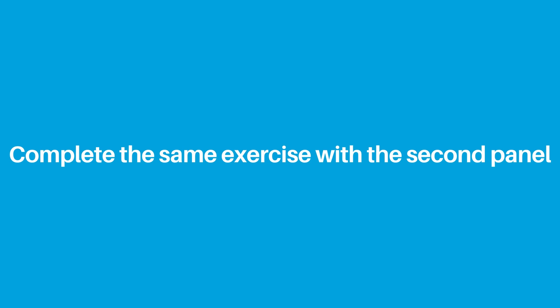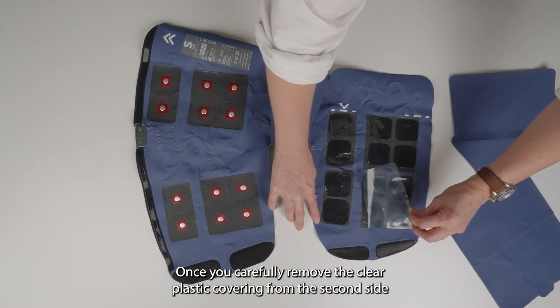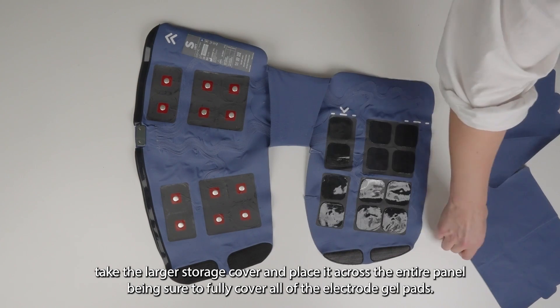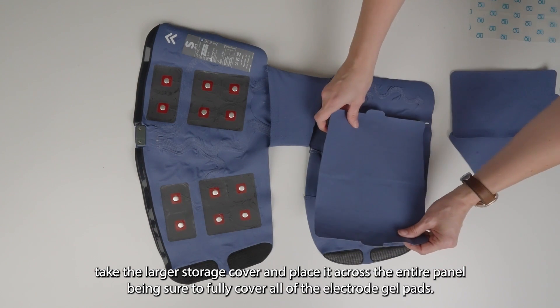Now complete the same exercise with the second panel. Once you carefully remove the clear plastic covering from the second side, take the larger storage cover and place it across the entire panel, being sure to fully cover all of the electrode gel pads.